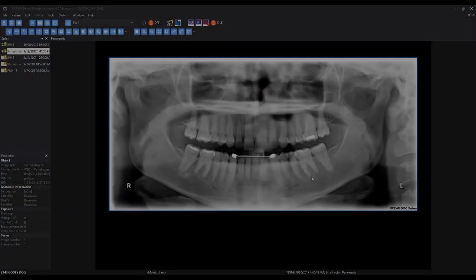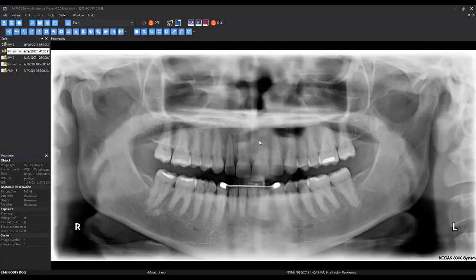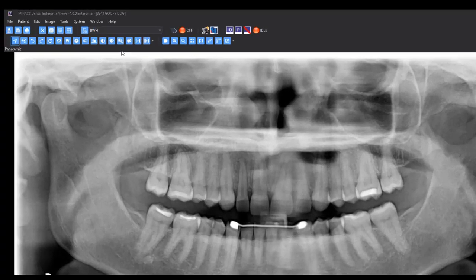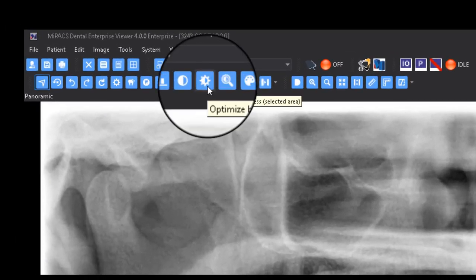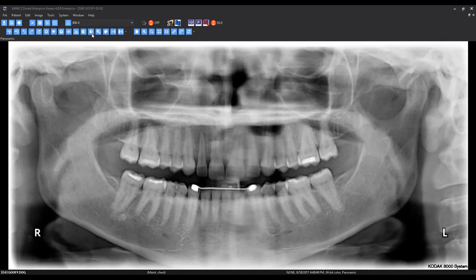The Optimize Brightness tool changes the brightness setting to be optimal for a selected area of the image. With this button selected, left-click and drag a selection of a particular area of interest.